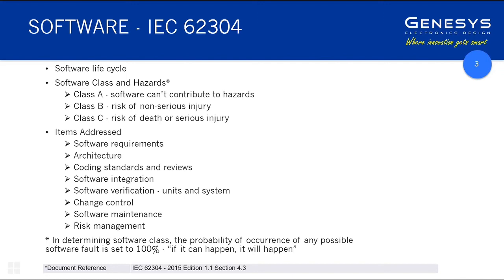And the important thing is that our design team is actually conducting observational and collaborative research. So what I was talking about earlier about prompting them with questions. If there's a quizzical look, we ask them if there's something that's confusing them, would this make it easier? You can quite often modify and change on the fly to actually start iterating and changing towards that positive outcome. We're doing one at the moment under ethics. That's also another way of doing it, but that tends to be more sophisticated with a smaller group.